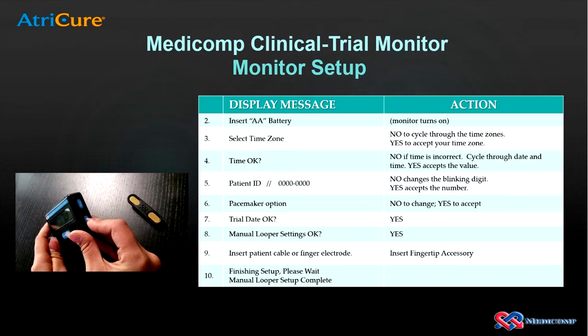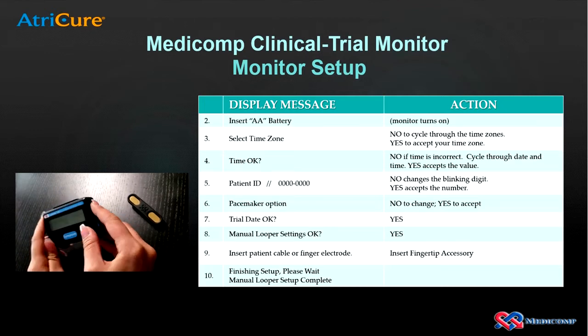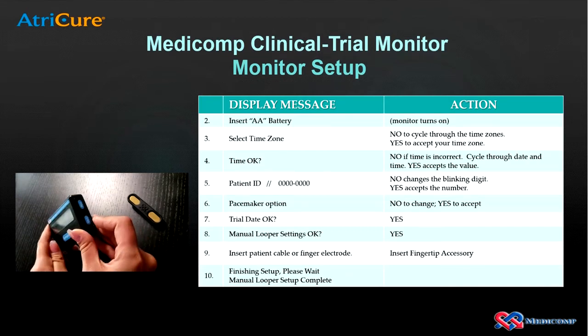The 6th step is the pacemaker option. The default setting is the patient does not have a pacemaker and you would press yes. If the patient has a pacemaker, press no to change the setting to on and then press yes to accept.